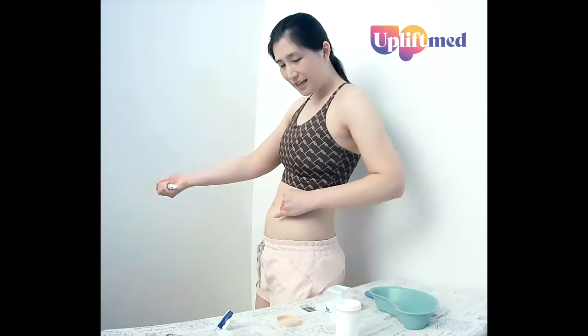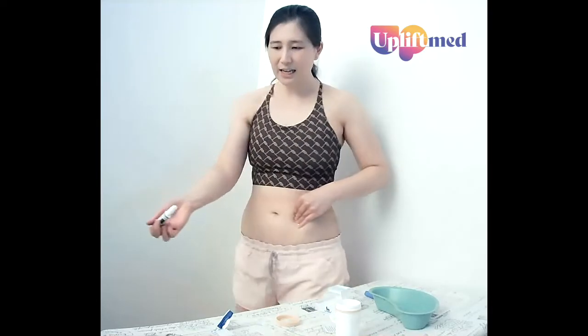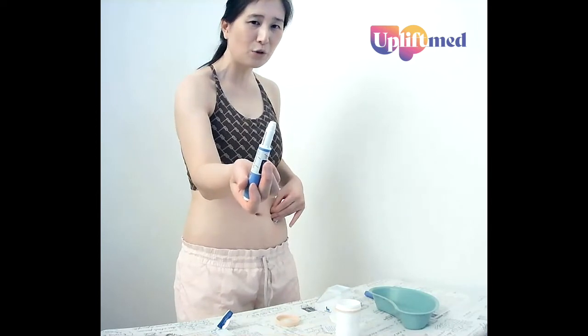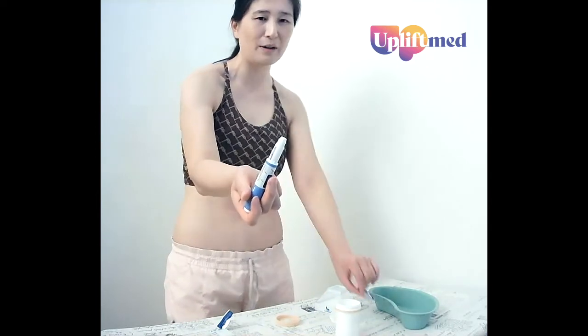We can put on a band-aid if you wish. Now we've got a needle to deal with, and often there'll be a little drop of fluid left over — don't worry about that.